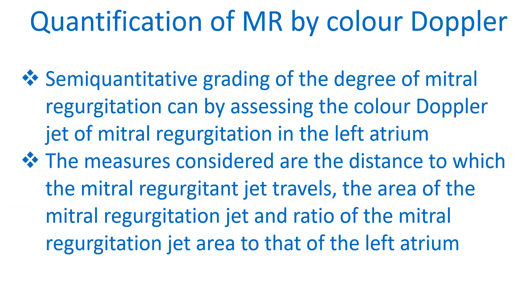Quantification of mitral regurgitation by Colored Doppler echocardiogram. Semi-quantitative grading of the degree of mitral regurgitation can be done by assessing the Colored Doppler jet of mitral regurgitation in the left atrium. The measures considered are the distance to which the mitral regurgitation jet travels, the area of the mitral regurgitation jet, and the ratio of the mitral regurgitation jet area to that of the left atrium.